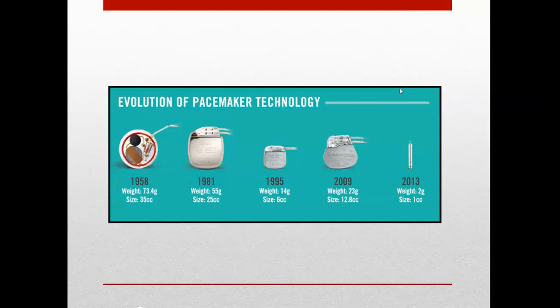Okay, the evolution of the pacemaker. The first pacemaker was developed by Paul Zoll in 1952, and it was mainly used in emergency situations. The patient had lead wires attached to a little belt, and the pacemaker was plugged into the nearest wall socket, and then a shock was delivered that stimulated the heart of the patient who was having an attack or needed to be shocked.